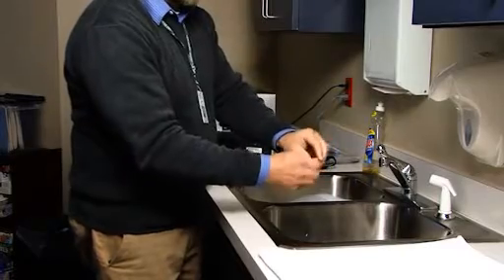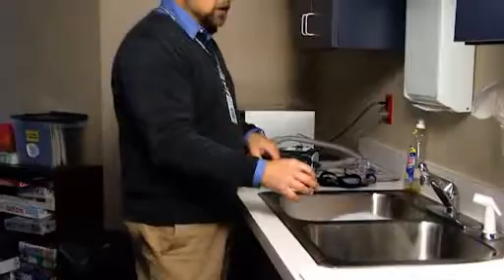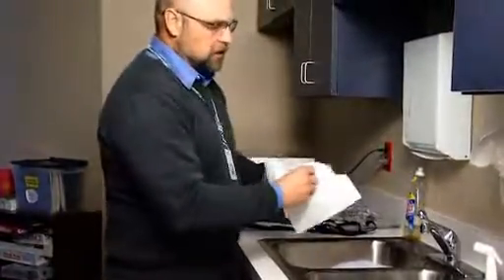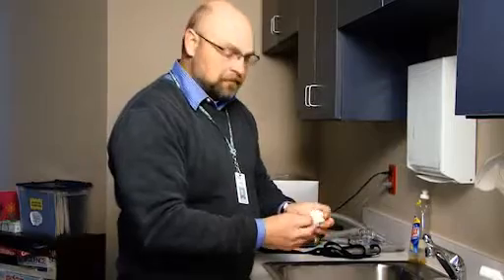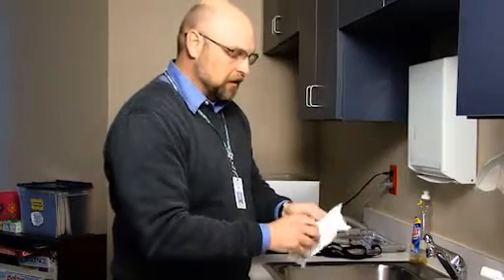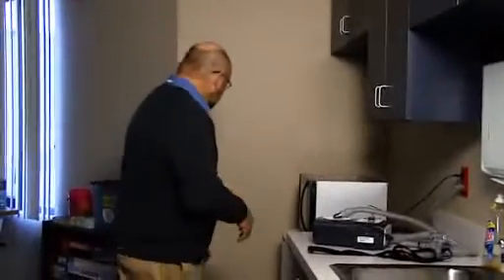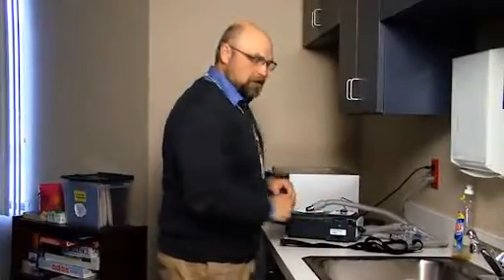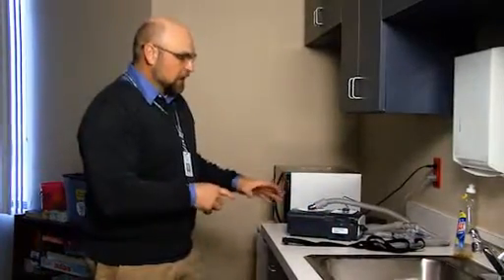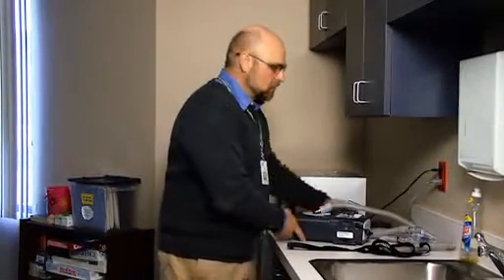You end up with actually two of them. You can put the clean one in here, and then what I do is squeeze it dry and maybe just set it out on a paper towel. You want to do that weekly, just to keep the dust out of your machine. Then you can put the dry one back in there. What that does is allow airflow so your machine doesn't warm up.